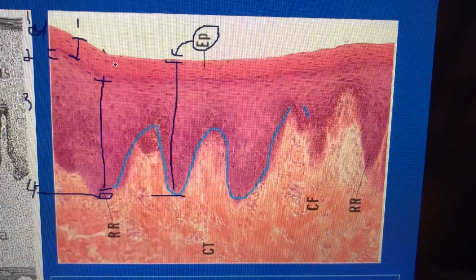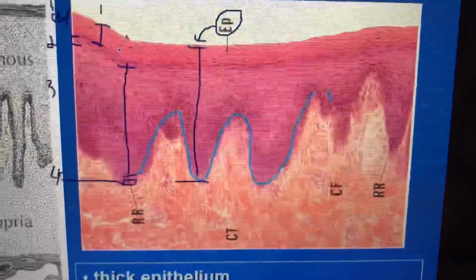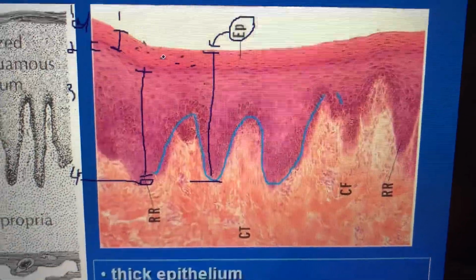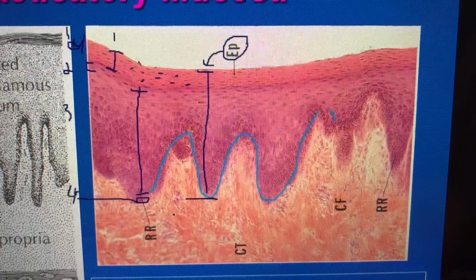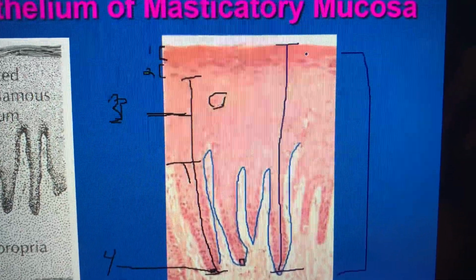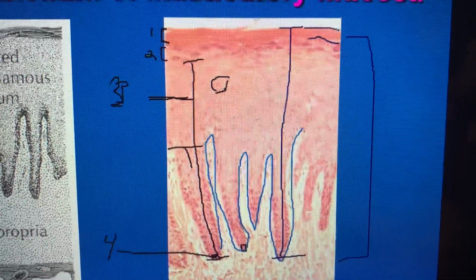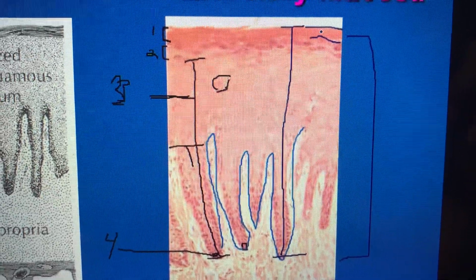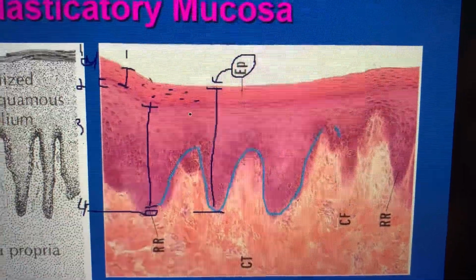Well, a little bit in that, but what did we talk about as the main difference last week? What do you see that's present in this? Is it the nuclei? Okay, great. Right, the nuclei are present. So we go back to this slide, no nuclei. You were right, Elio, about the thickness, but that's not really how you tell the difference. You look in here, there's no nuclei, and then in this cornified layer there are.